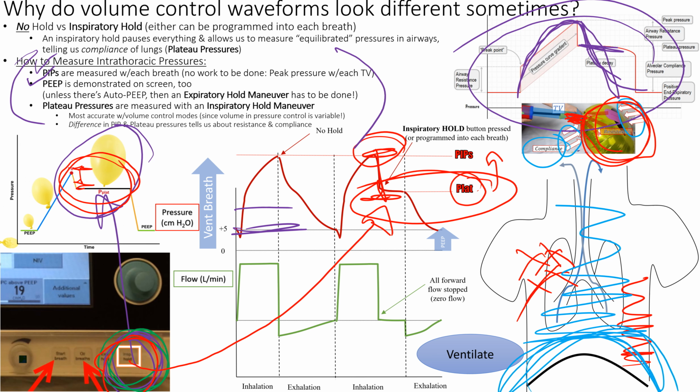Do I need breathing treatments? Or is the patient biting? Do I need like a bite block? Or do I need to change the HME on the ventilator tubing because it's causing my pressure to be high? Or is the ET tube too narrow, like 6.5, and maybe they have crusties inside and we need to change it to a 7.0? Or is it a patient that needs diuresis to get some of this fluid out, or more antibiotics, and they're going to improve from day 1 to day 2?